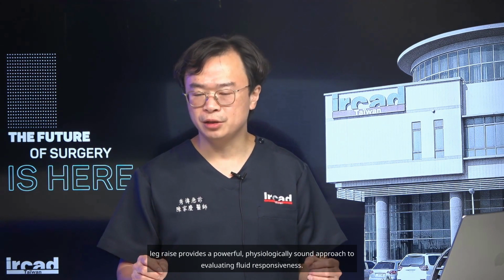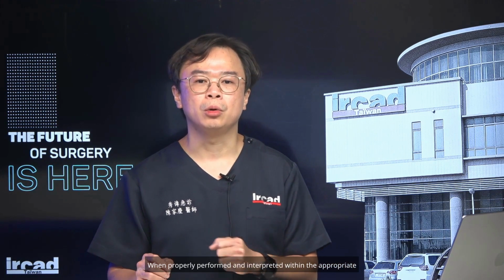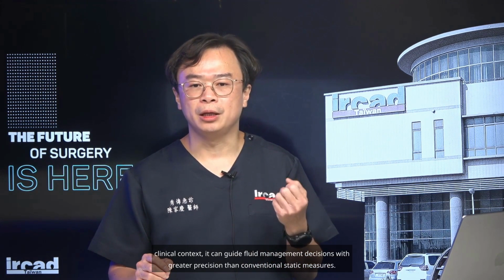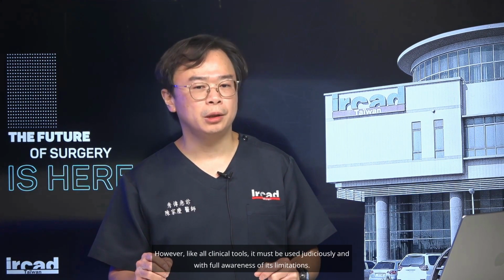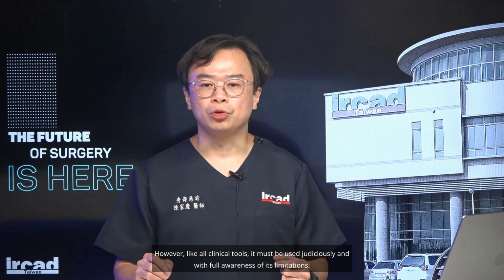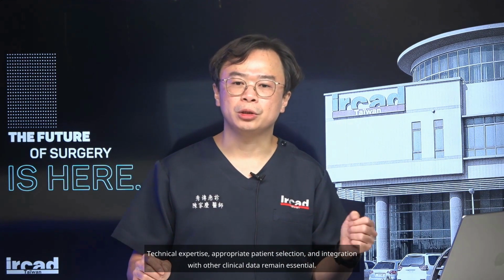Conclusion. LVOT VTI assessment, combined with dynamic maneuvers like passive leg raise, provides a powerful, physiologically sound approach to evaluating fluid responsiveness. When properly performed and interpreted within the appropriate clinical context, it can guide fluid management decisions with greater precision than conventional static measures. However, like all clinical tools, it must be used judiciously and with full awareness of its limitations. Technical expertise, appropriate patient selection, and integration with other clinical data remain essential.